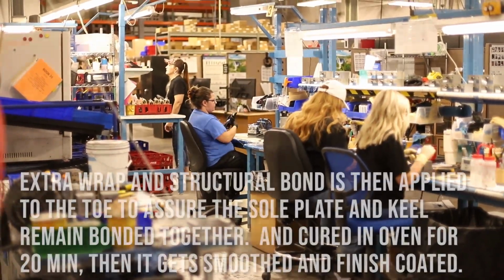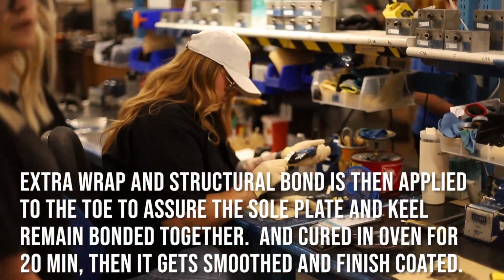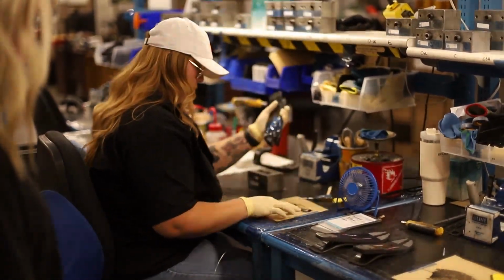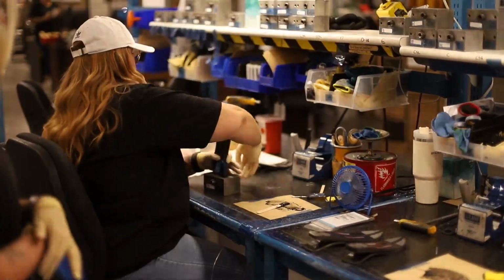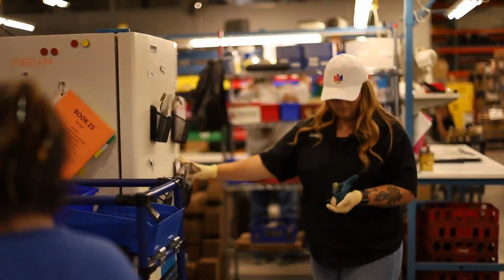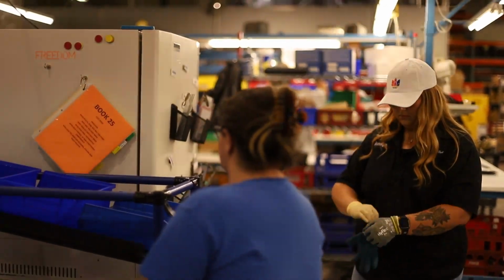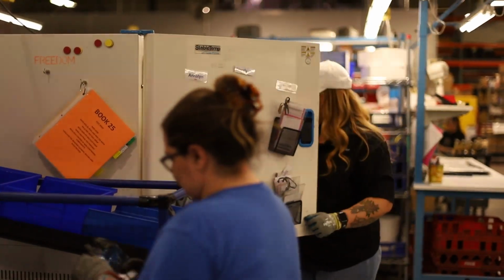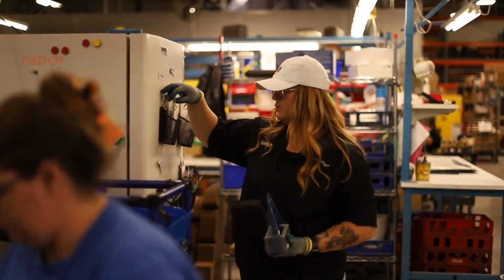It's actually very similar to what we were doing in the layup of the components themselves, is making a composite. So we're using a very similar fiber, and we're using very similar adhesives, and we're making a composite on top of the composite components and curing that, and that's what we're using to hold these specific designs together. The same amount of pressure, so they're all getting in the mold. And then you put it in another autoclave? No, we cured it in just a standard oven. And the pressure, instead of coming from the autoclave and the vacuum bag, the pressure came from the tool. So we applied the pressure with the tool this time.